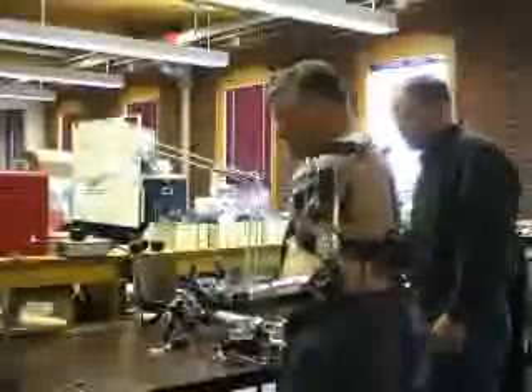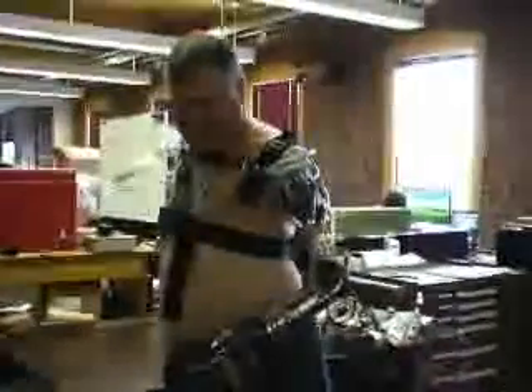Hildreth lost both of his arms when he was electrocuted 26 years ago. Today he's testing a Luke arm on his left side where he still has a short residuum. When asked what it feels like wearing it, he says: "It's kind of liberating. I've been without an arm for 26 years."